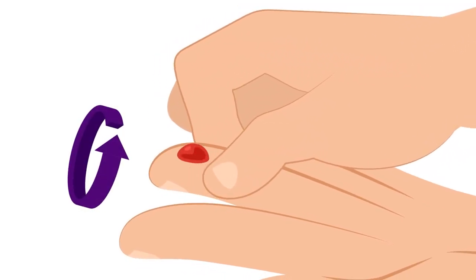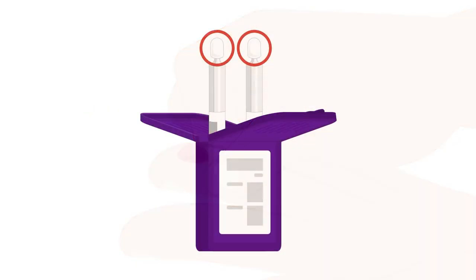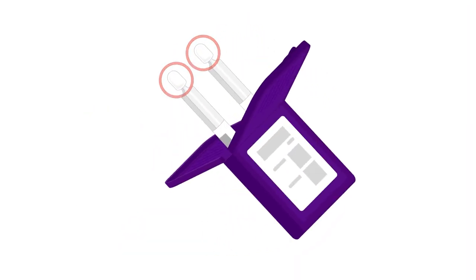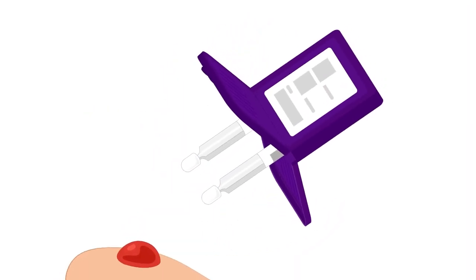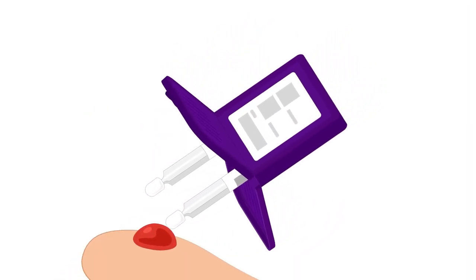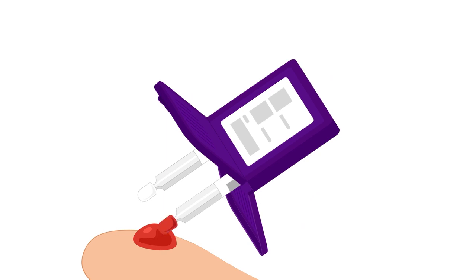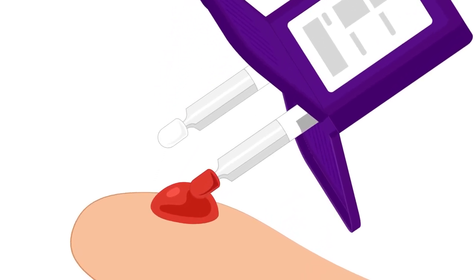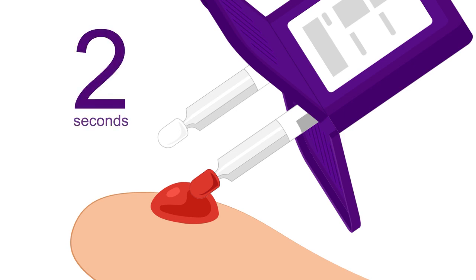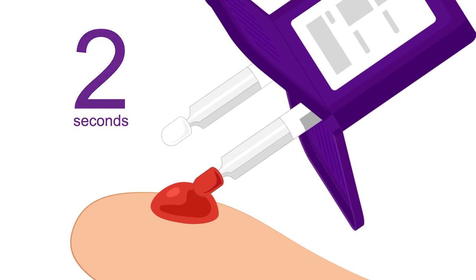Each sampler has a white tip that absorbs the blood. Touch the tip to your blood drop and watch it turn red. The tip should always touch the surface of the blood drop from an above orientation so that it's pointing towards the floor. Count two seconds after it fully absorbs before moving to the next sampler.